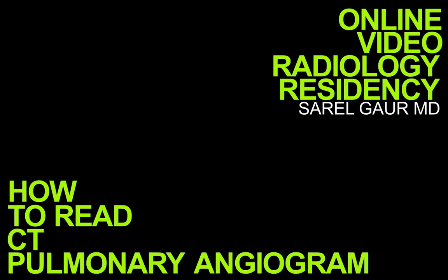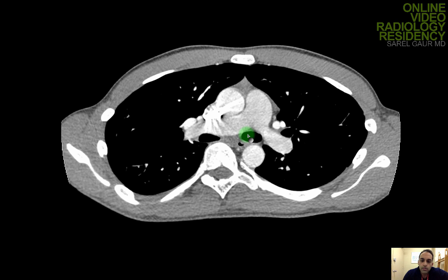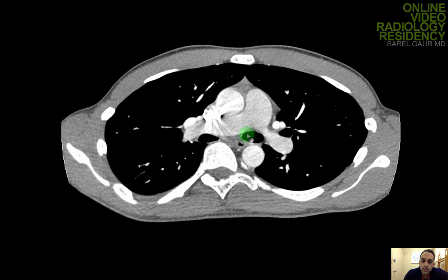Let's go through a positive case so we can know what an acute pulmonary embolism looks like on CT. This is a patient that is recently post-op, a younger patient, that came into the ER complaining of shortness of breath. The CT pulmonary angiogram was requested and performed.